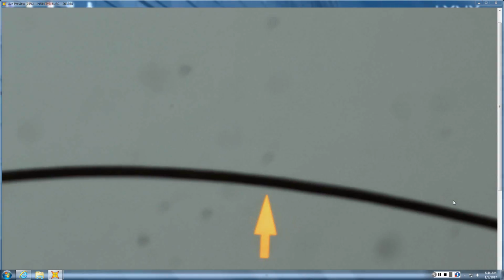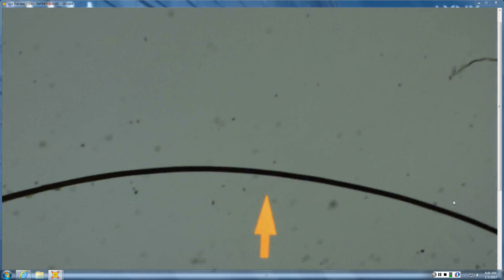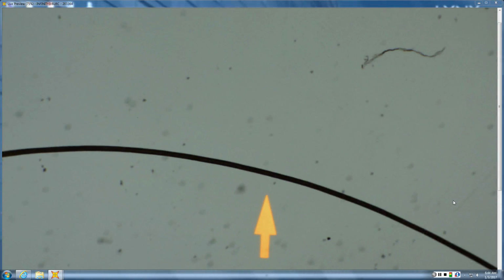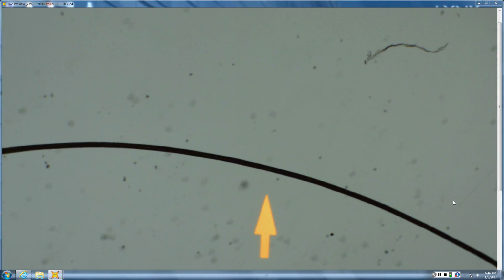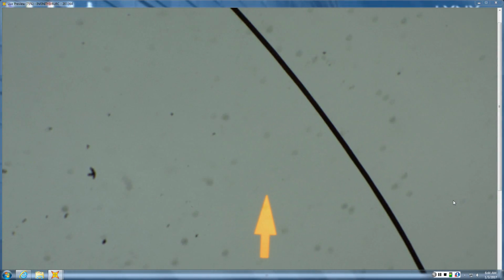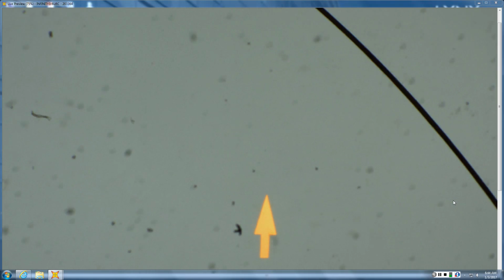So this is a hair shaft, and there's two of these in this box. This, I think, is actually a better example, having looked through them. But this is supposed to be an exclamation point hair, and clinically that is an indicator of alopecia areata. And what that means is that it looks like a little exclamation point, mainly the top part of it. You don't see the little dot that's below it, but you're seeing this darkly pigmented, normal hair of normal width, and then all of a sudden it tapers down and actually starts to lose the pigment.